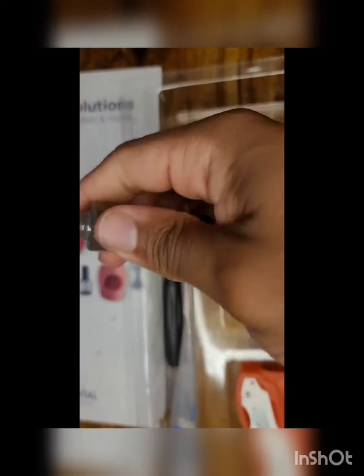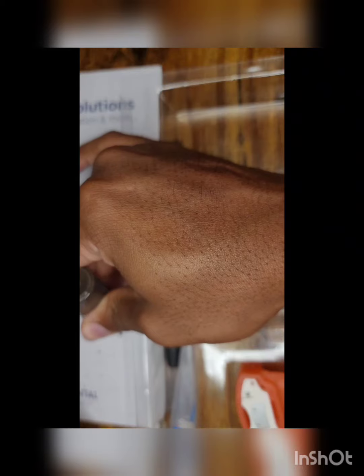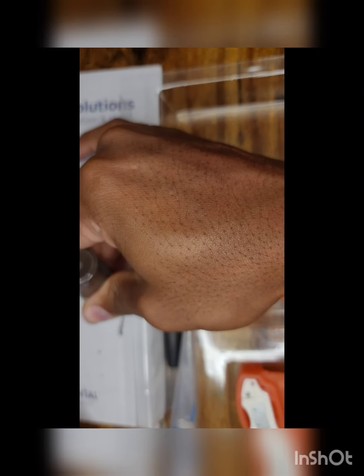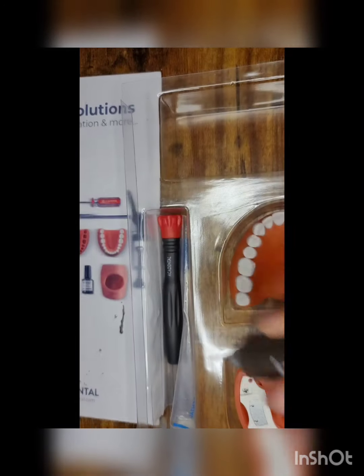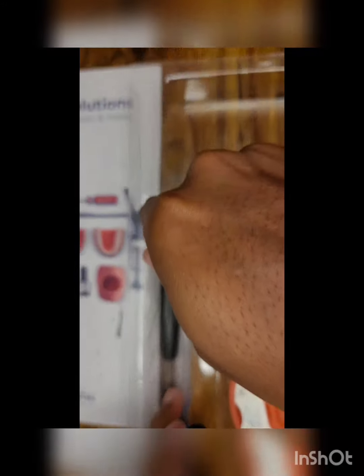Basically you just shake it up, as I am doing in this photo, and then you just go ahead and squeeze the bottle out — I'm using the back of the box there. It does take some time to harden, not too much longer. And if you want to speed up the time, just go ahead and hit it with the curing light.